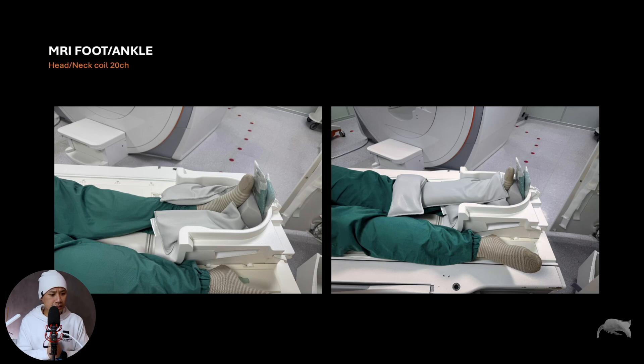If you're considering a flex coil, you should definitely get one — because the flex coil is not only for foot and ankle; it's used for the whole body: the elbow, arm, forearm, and more. It's very versatile. But the head coil is a great second option — a Plan B protocol. It's very good to know that it's possible and to have that backup plan.